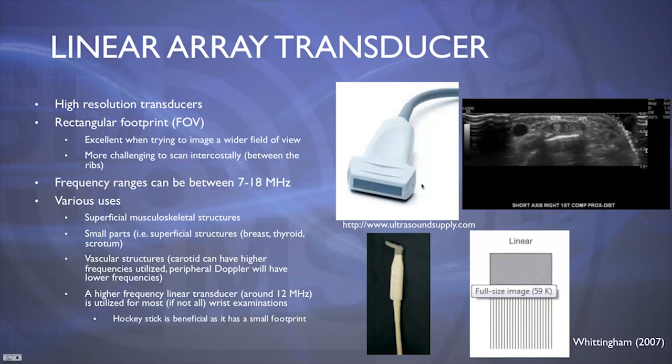You may find, though, that the traditional linear transducer that we will be using too is very beneficial because it has a little bit different image resolution. The hockey stick probe is very high resolution, so it can almost appear a bit pixelly, for lack of a better term, and so the higher resolution, just traditional linear transducer will be even more beneficial, possibly depending on how the resolution appears on your screen.